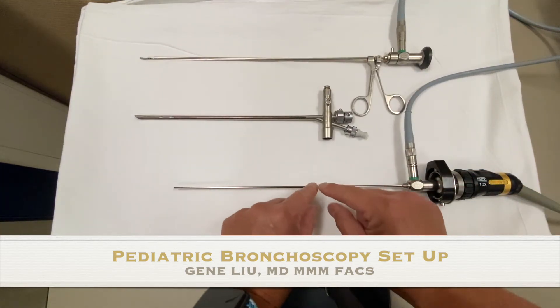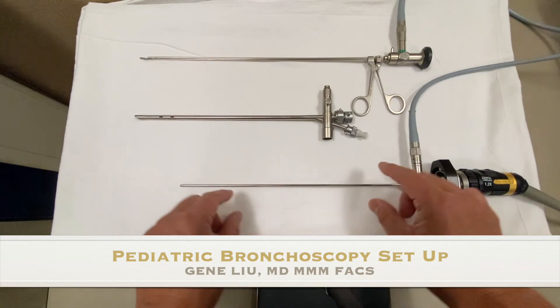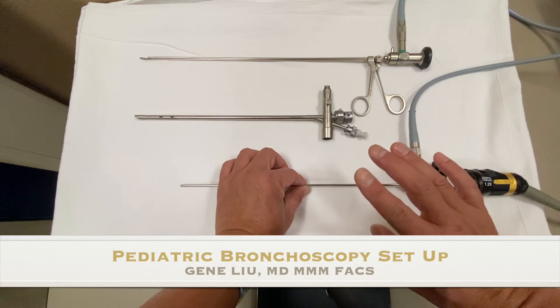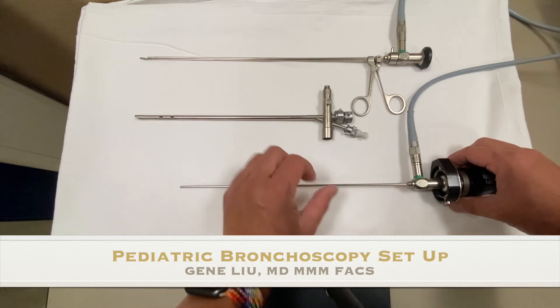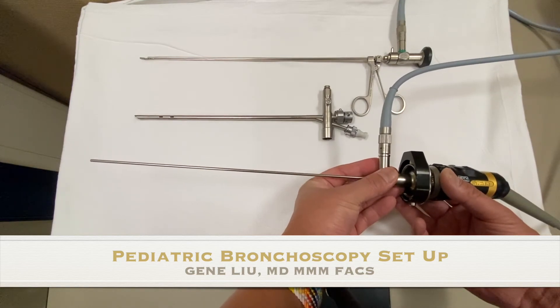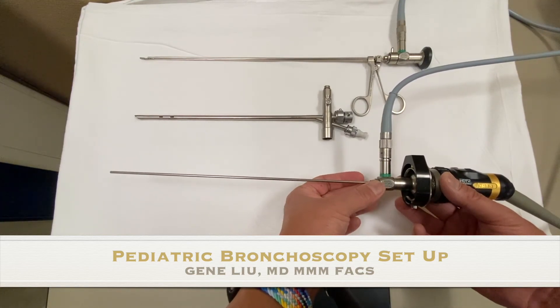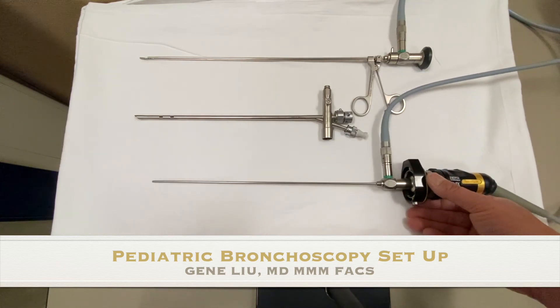Something critical to mention is that this telescope is made up of a series of mirrors all the way through. If there's any pressure that causes it to bend, it's going to crack those mirrors and render the telescope useless. Always make sure that when you grab it, you grab from the camera or the fat part in the back — never grab it from the shaft of the telescope itself.